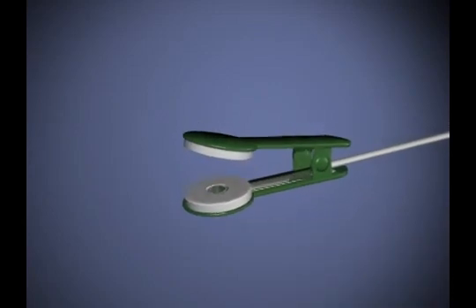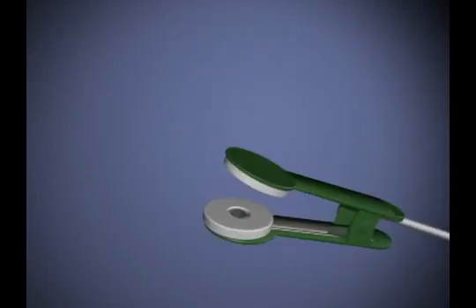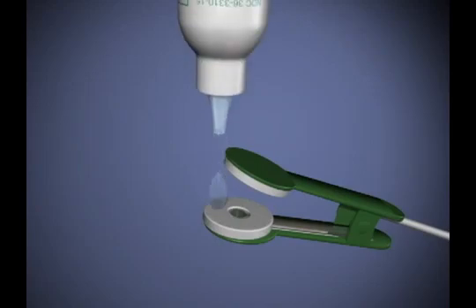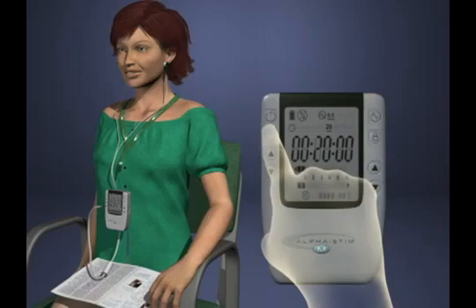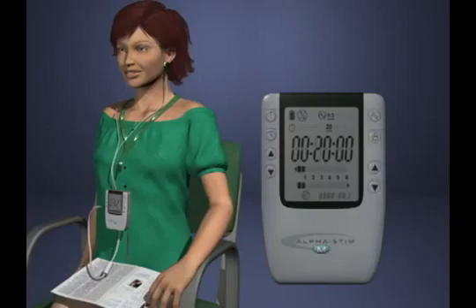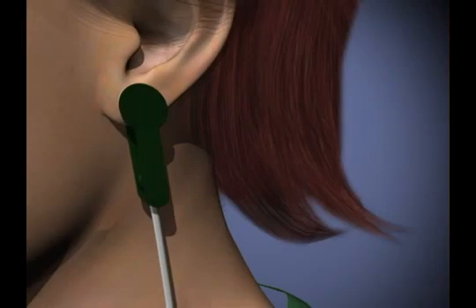Saturate the ear clip electrode pads thoroughly with several drops of alpha conducting solution while they are on the ear clip electrodes. Power on. Set frequency to 1/2 Hz. Set timer. 20 minutes is usually enough time if the current is set to at least 250 microamperes. 40 minutes to an hour or more is recommended if the current is at or below 200 microamperes. Squeeze ear clips open and apply one to each earlobe.